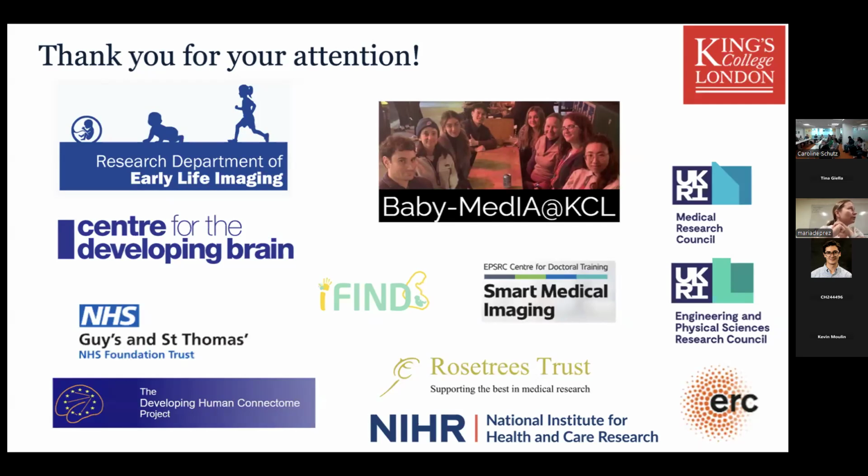Yes, so I'm using something called edge preserving regularization, which is in between the L1 and L2 norm. So in the work in Lausanne, they used the L1 norm and that gives you sharper edges. Some people use the L2 norm and that gives you blurry results. So that's the primary thing. There might be some differences in how the point spread function is used, so there will be some minor differences causing this. Also, density matching. So we would expect some intensity artifacts potentially in the reconstructions.